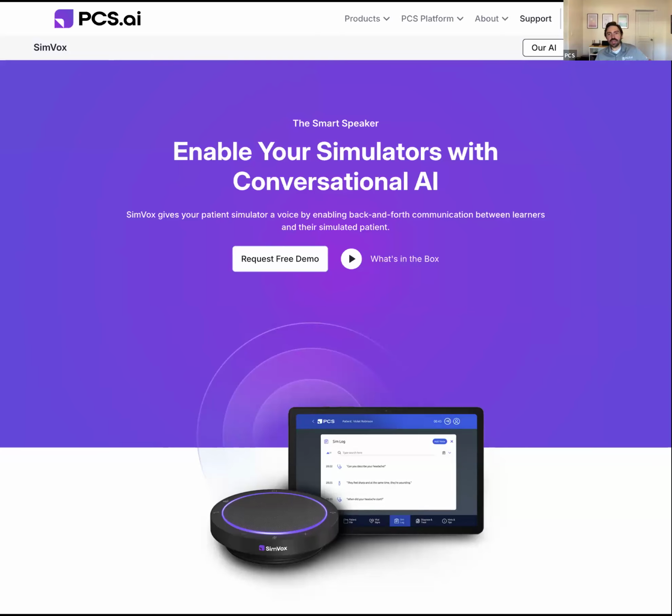What we're going to be talking about today is SimVox Pro, what it is, how it works, and how it can benefit your simulation center. Essentially, SimVox Pro is a smart speaker that you can pair up with any manikin, be it a low fidelity, mid fidelity, or even high fidelity manikin, to add communication training to that manikin. What SimVox does is provide a voice for your manikin. Learners can ask questions about what's going on with the patient, and the patient is able to understand and then respond back given the scenario that is being run.